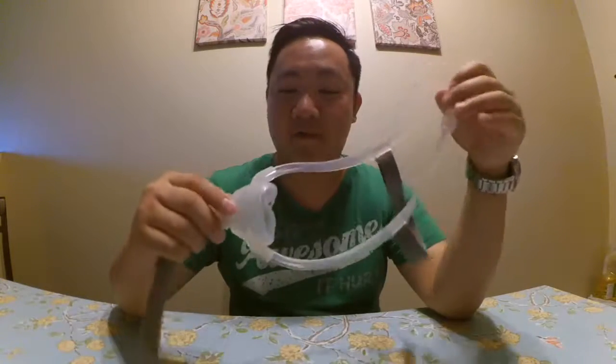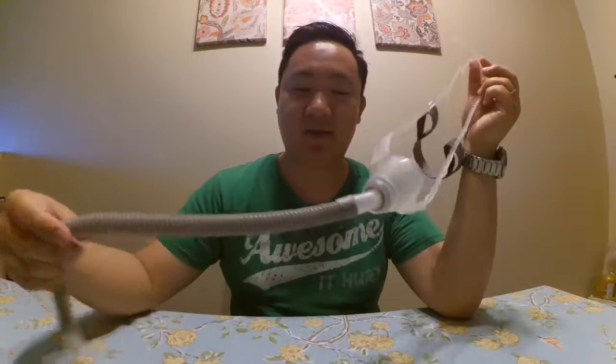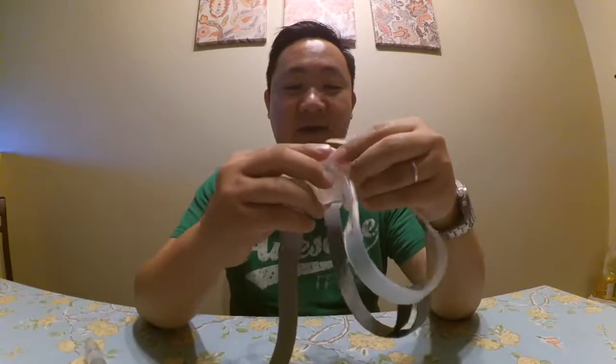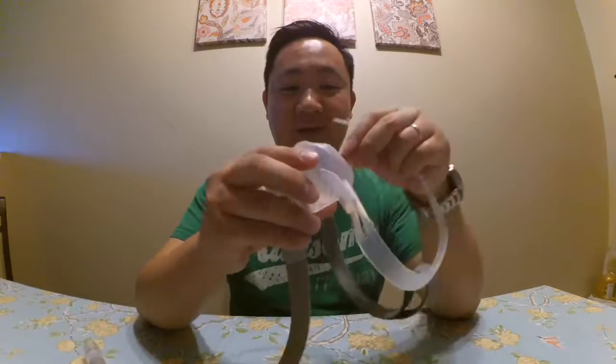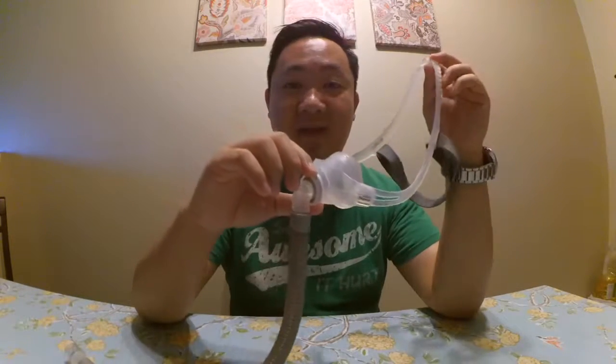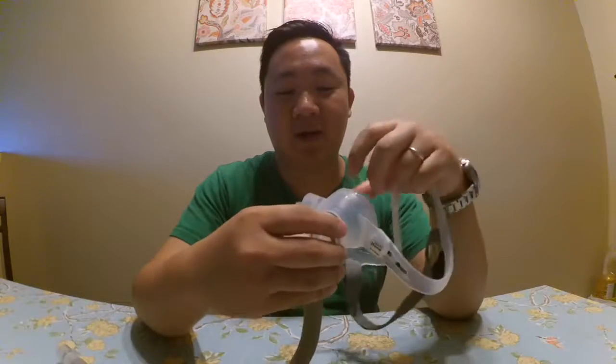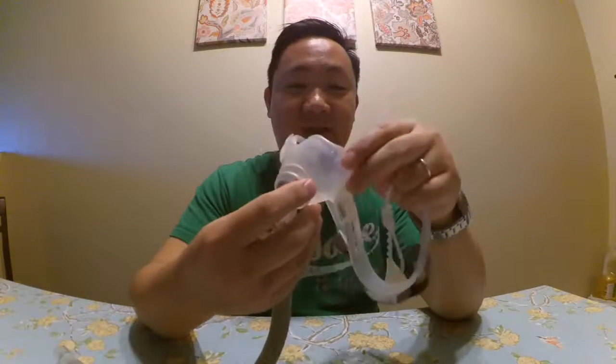I'm here to do a review of the ResMed Swift FX Nano CPAP mask. I've been using this for quite a while now and I really like it. I also have the AmeriMask from Philips and I like it too when my nose is clogged up, but if I have a choice I would rather use this instead.